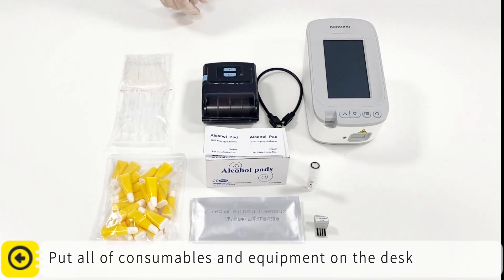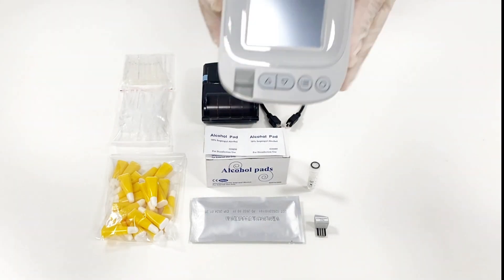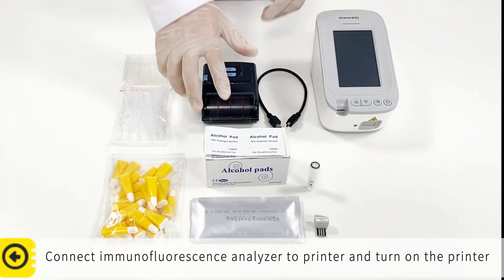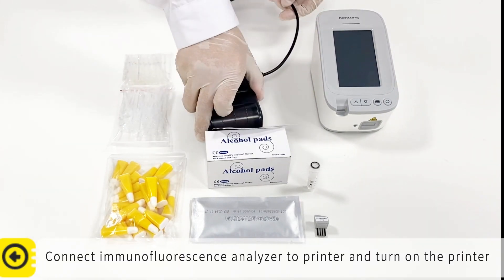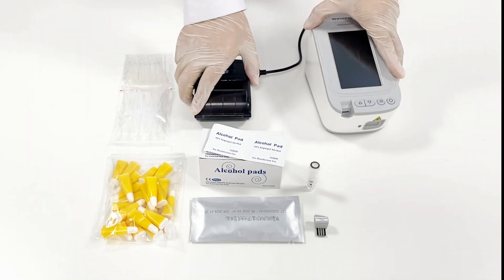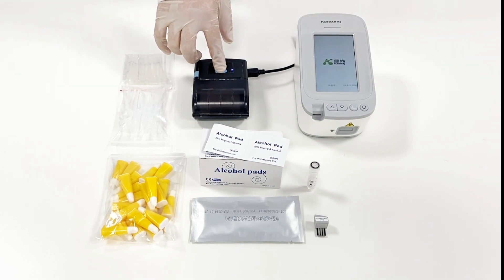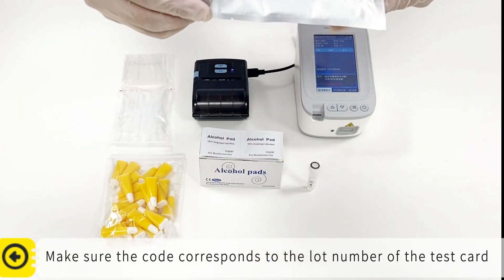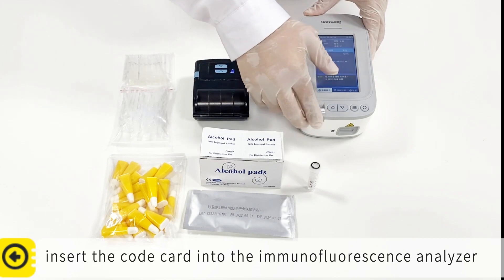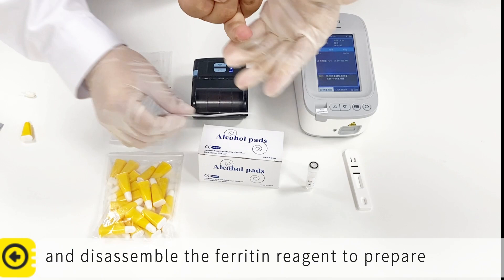Put all consumables and equipment on the desk. Connect the immunofluorescence analyzer to the printer and turn on the printer. Make sure the code corresponds to the lot number of the test card. Insert the code card into the immunofluorescence analyzer and disassemble the ferritin reagent to prepare.